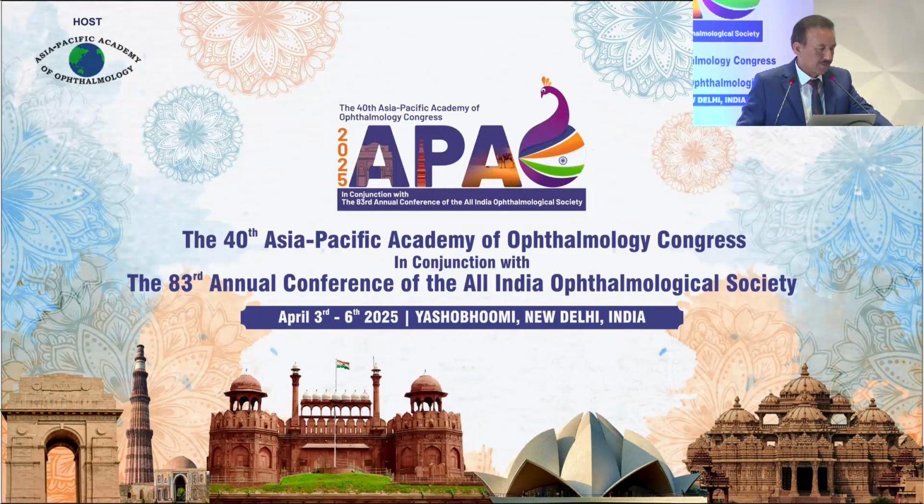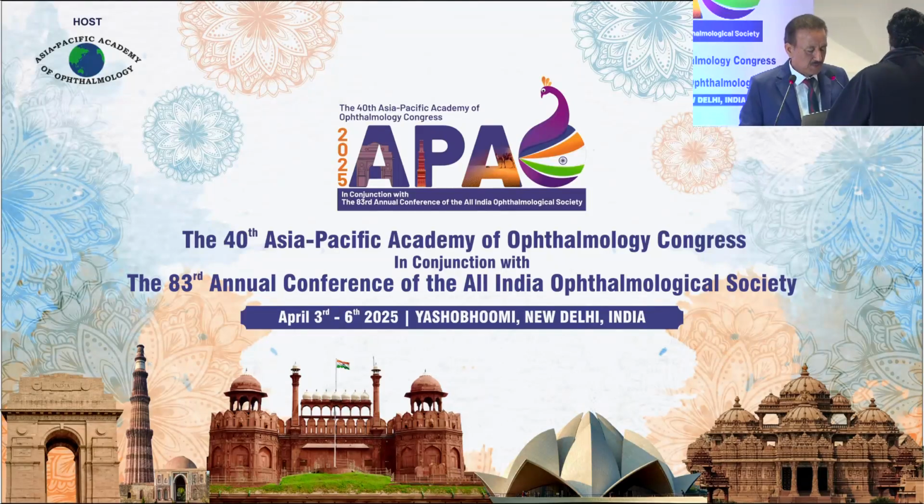And we have seen a lot of our eminent speakers have spoken already. Meanwhile, I'm just going to talk on a very, very hard cataract, rock hard cataract, how to manage these rock hard cataracts when you don't get the crack in the hard cataract.